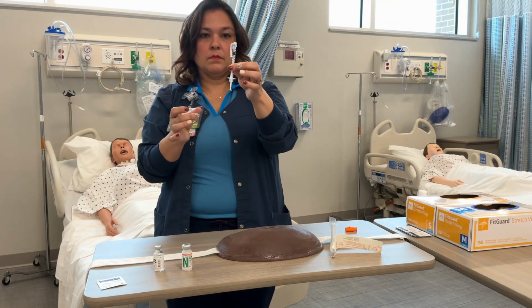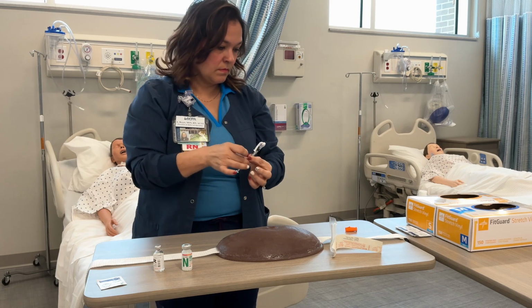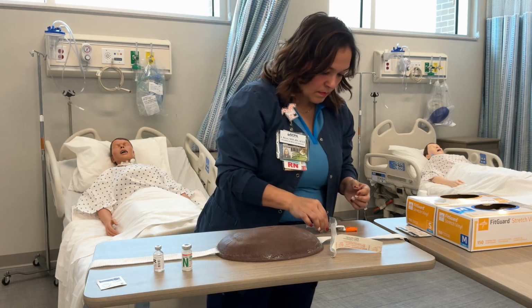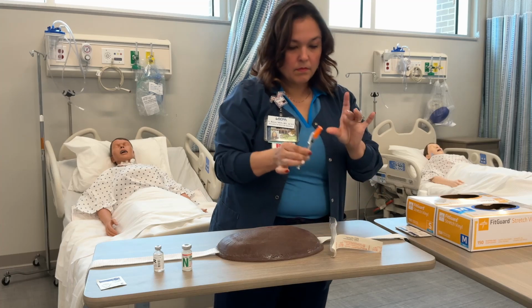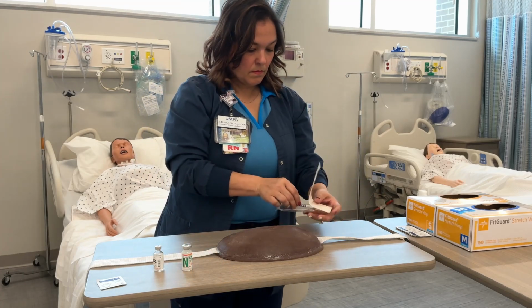So now we're going to remove the needle from the vial and recap the needle and label the syringe before walking to our patient's room. All right, so we have 10 and 10.